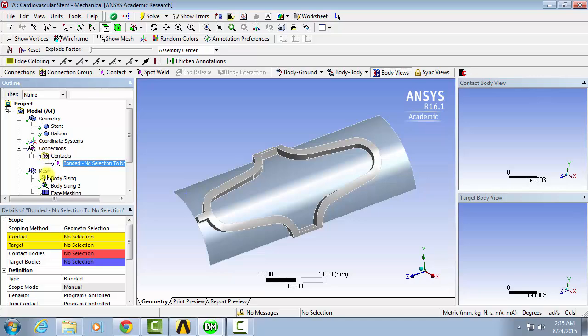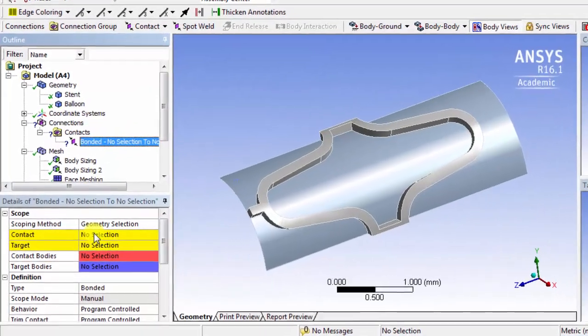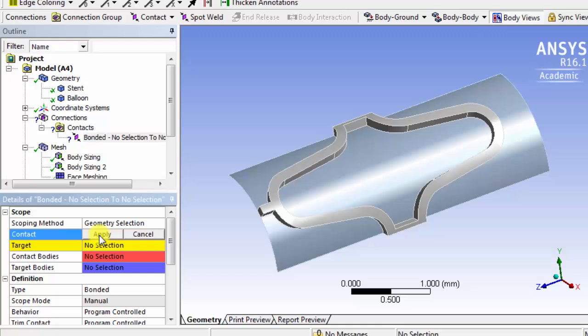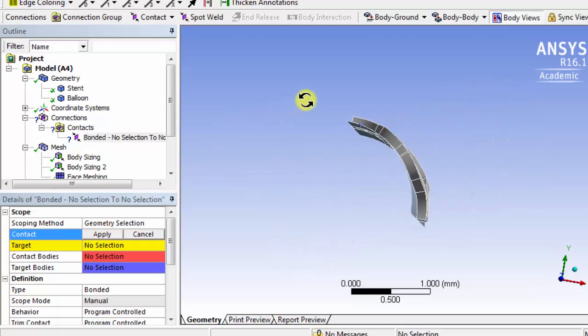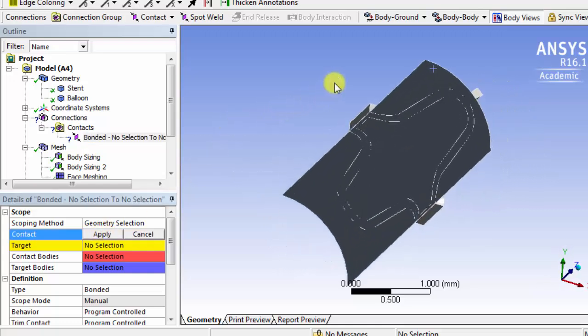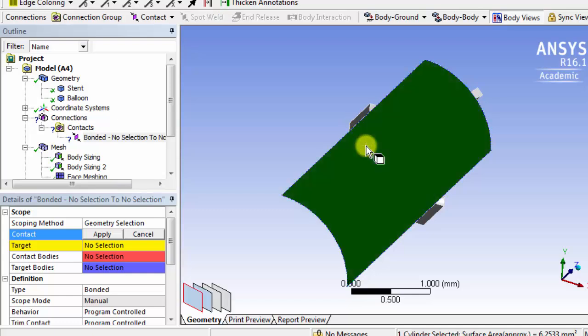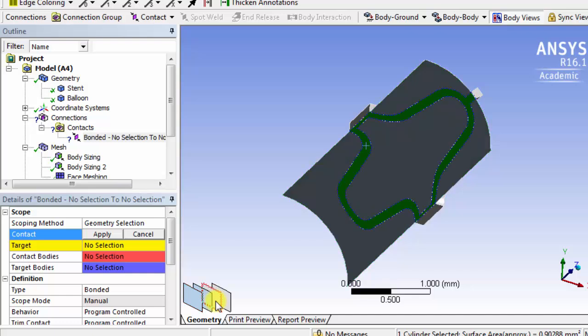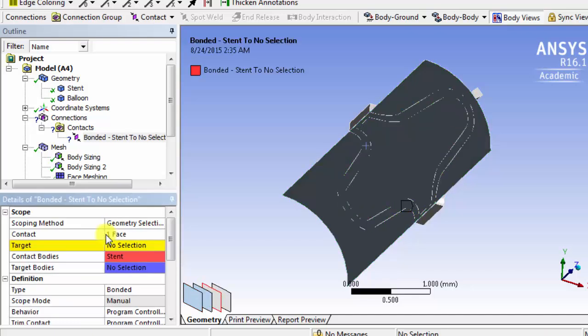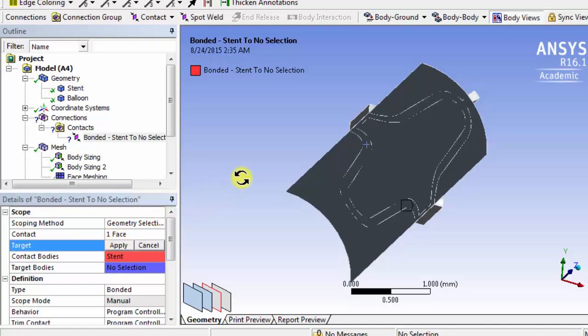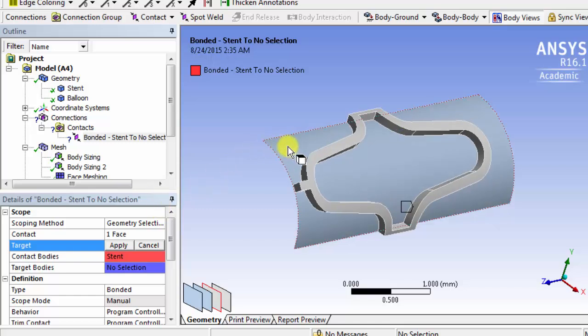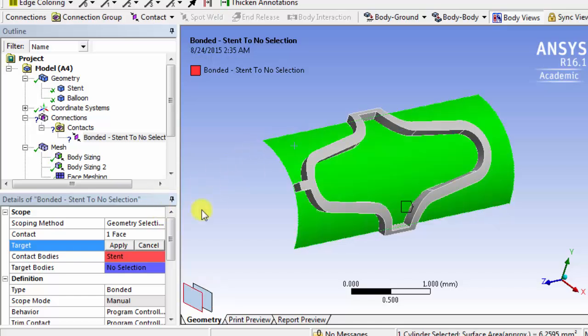Here we'll start by selecting the contact and the target surfaces. So the contact we'll select to be the bottom surface of the stent. Just select through the balloon face, and select the bottom surface. Then hit apply. And then the target will be the top face of the balloon. So just select the top face, and then hit apply.